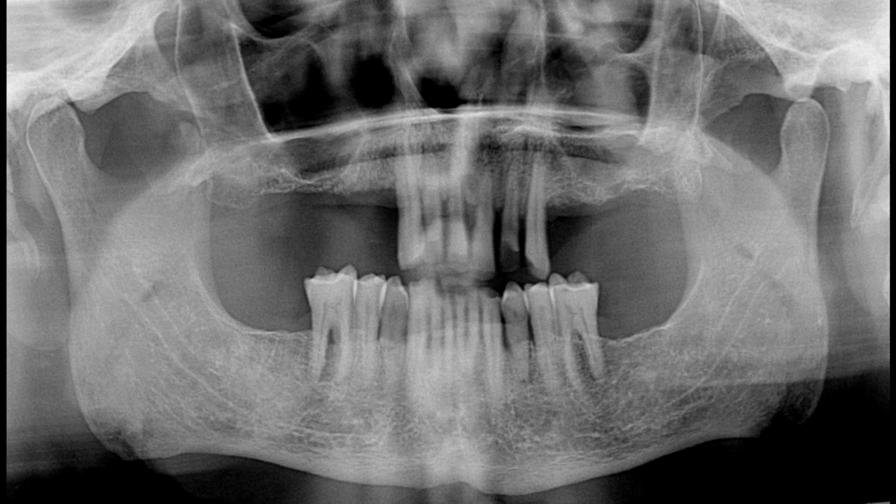Today I want to show you this very interesting dental implant case. It's a full mouth dental implant treatment, and as you can see here, the patient has a number of different diagnostic findings. He's missing bone in the upper jaw, in the back quadrants. He's also missing bone around the teeth between 40 and 50% in the upper jaw, and missing bone in the lower jaw between 20 and 40% or so.